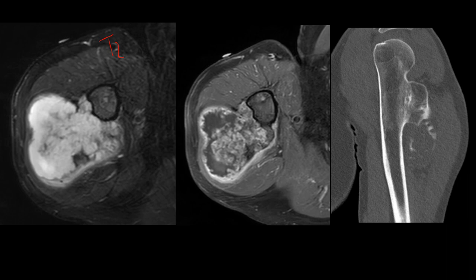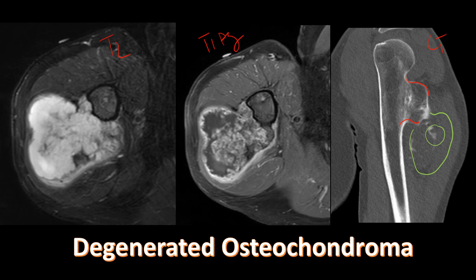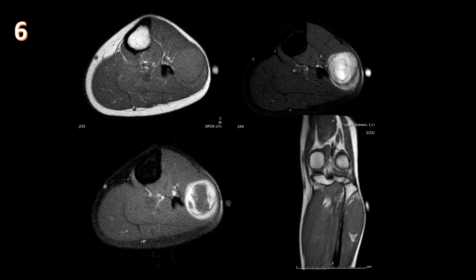MRI in T2, T1 post-contrast, and sagittal CT clearly show the osteochondroma with an enlarged cartilaginous cap containing chondroid matrix — consistent with degeneration to a chondrosarcoma. Post-contrast images show central and peripheral enhancement of the lesion and surrounding tissues, with classic very high T2 signal intensity of the chondroid component. Remember to always keep an eye on that cartilaginous cap.